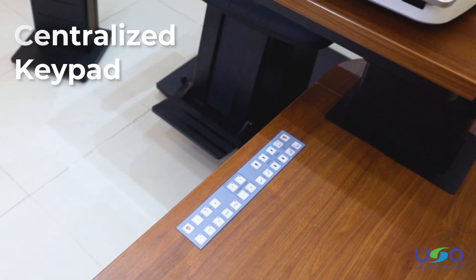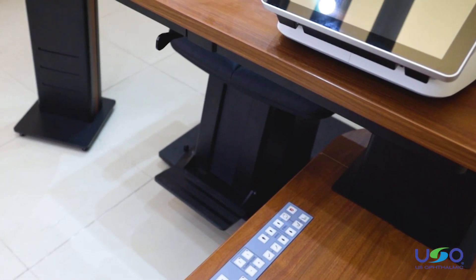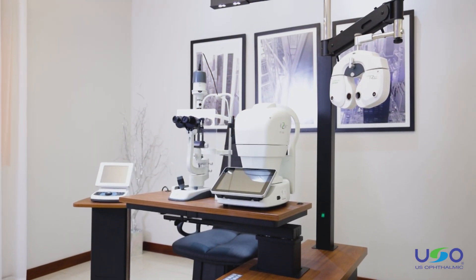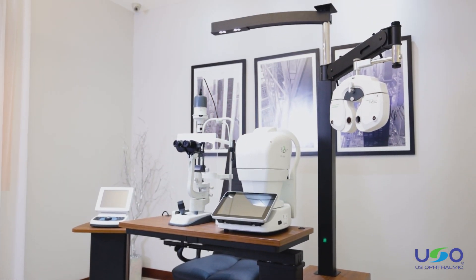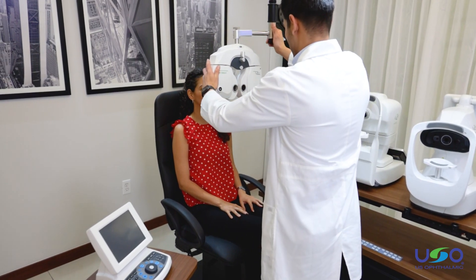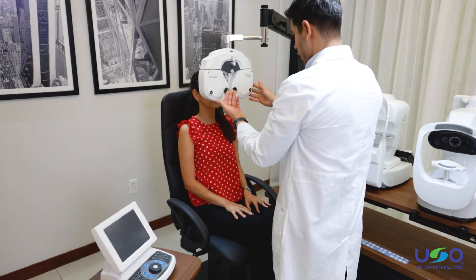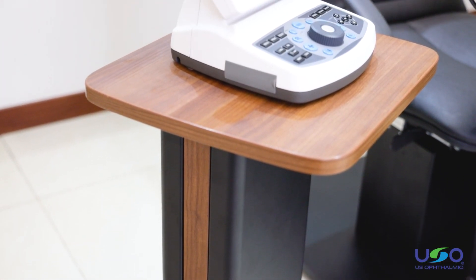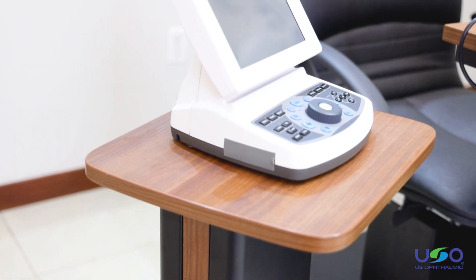The built-in keypad is a centralized location for the doctor to adjust the chair and table, turn equipment and the lamp on and off, and dim the lights. The faux-roptor and lamp on this unit are easy to move manually. The Venetia is also designed with an optional small table, which can be used to support the faux-roptor control panel.